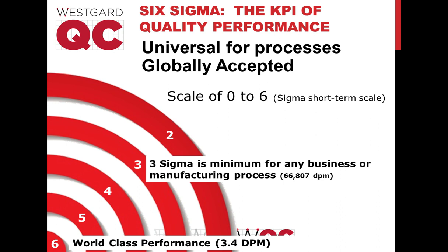Can we use the manufacturer control just to obtain our CV and SD and an external control to obtain our bias?